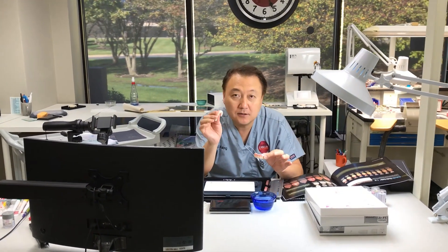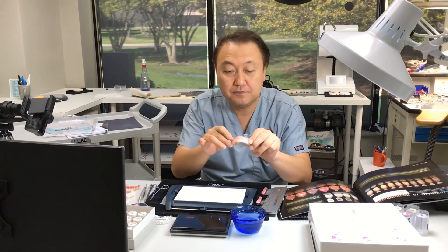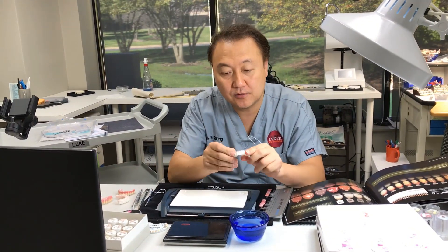Hi, today I would like to talk about the Pink Aesthetic, which is Jingjiva — the Zirconia Pink Aesthetic. This is the final work, and here's the final two. We do have some of the live cases too.